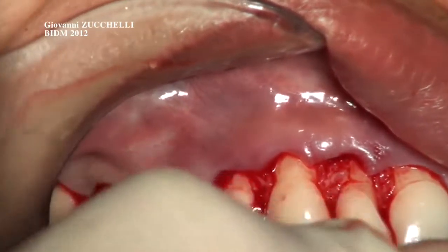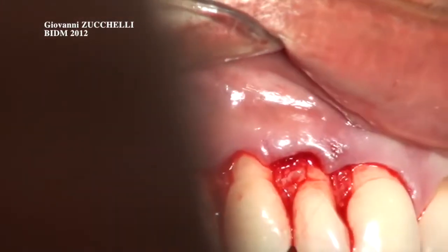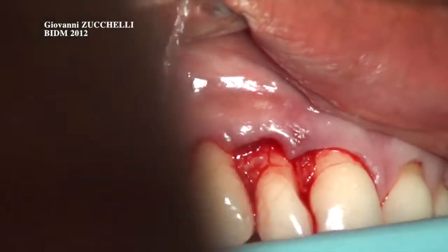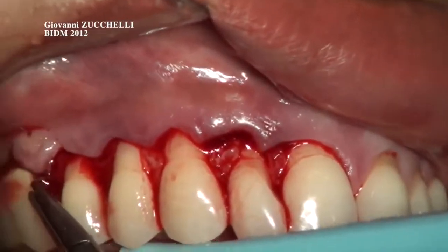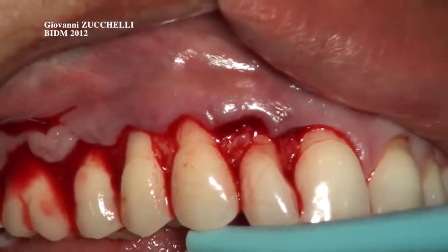Sometimes when you have a crown, please may I have some suction from the other side. I have your head in the microphone. Yeah, I know this is the area in which it's more difficult to follow, just to show you that this suture must perforate together, right?